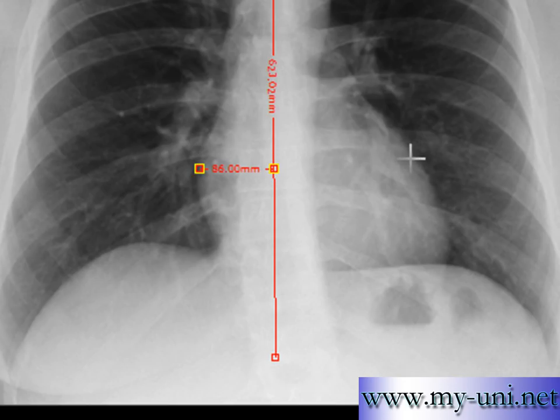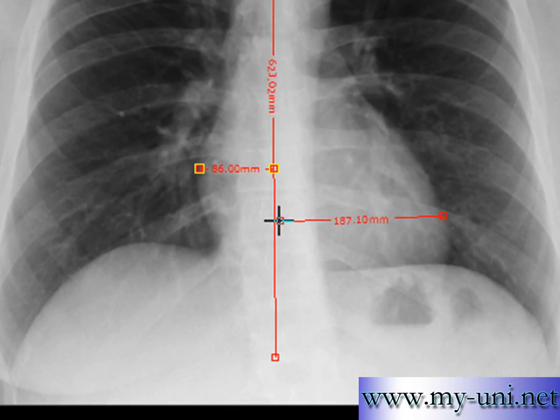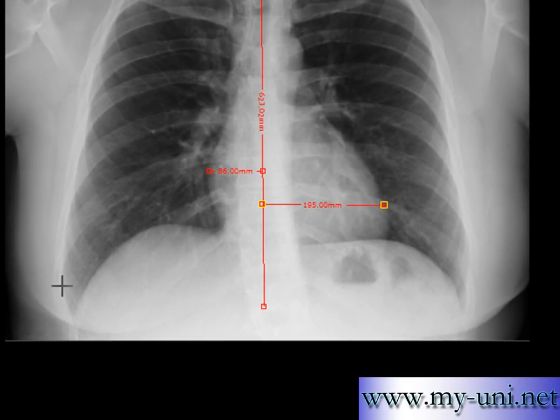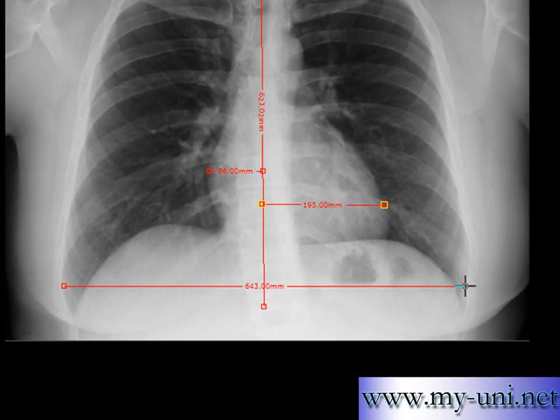Similarly, on the left hand side, find out the maximum extension of the cardiac shadow, which is somewhere here, and make a measurement from this shadow to the line. This number plus this number is the transverse diameter of the heart. Then make another measurement for the maximum width of the thoracic cavity.